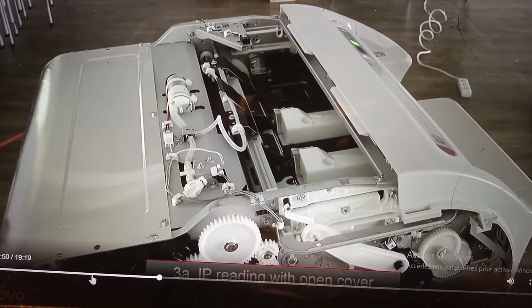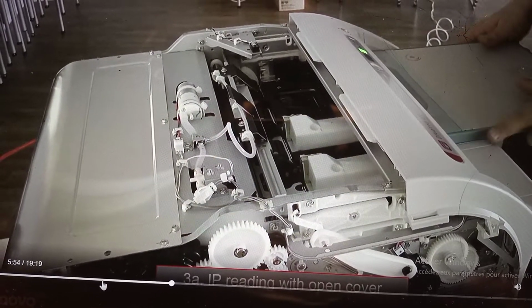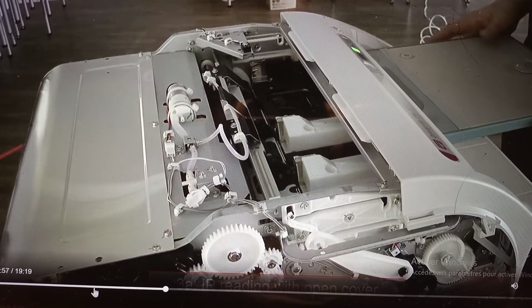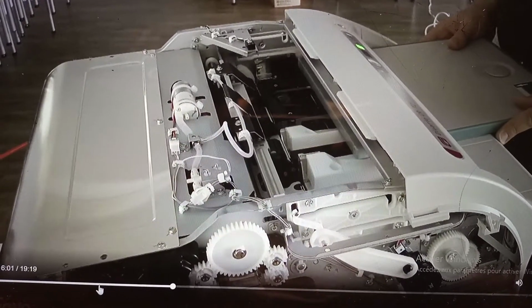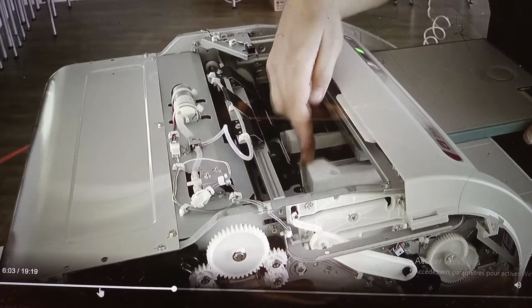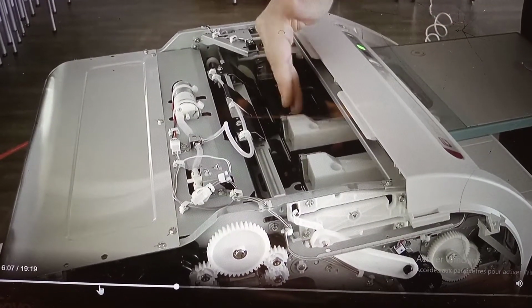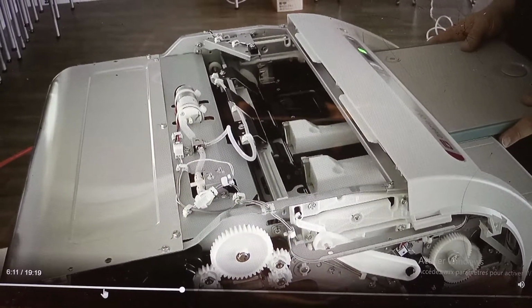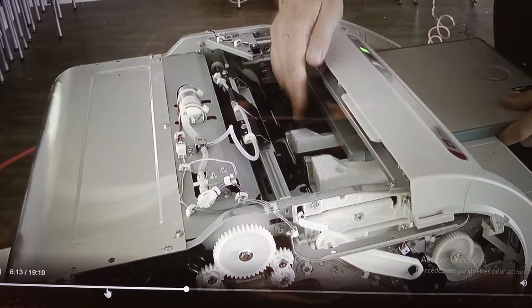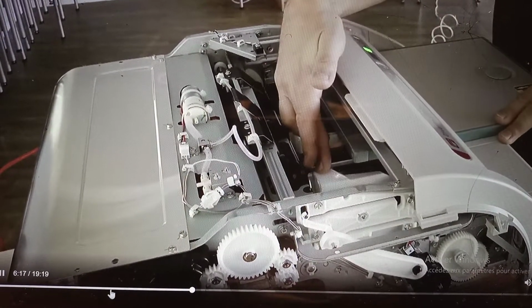So next step, I just want to show how the readout process in the device is working after inserting a cassette. So as you can see, we have a sensor for detecting the cassette size. So if it's the smallest cassette, no sensor will be activated. If it's a mid-size cassette like this one, one sensor will be activated, and if you have a big cassette, both sensors will be activated.